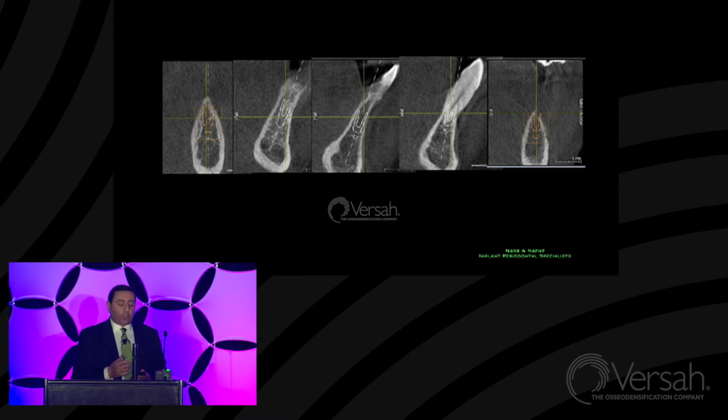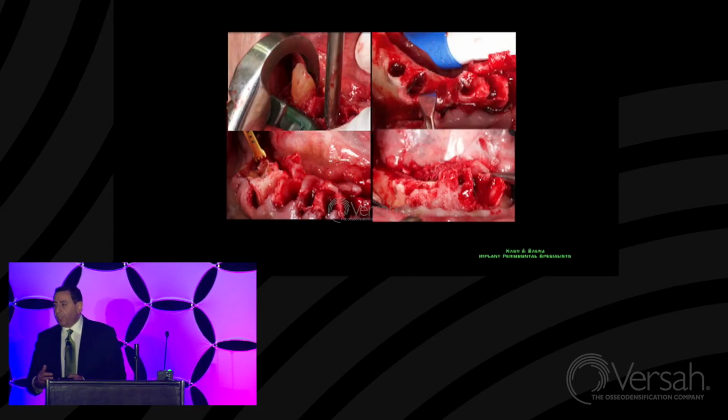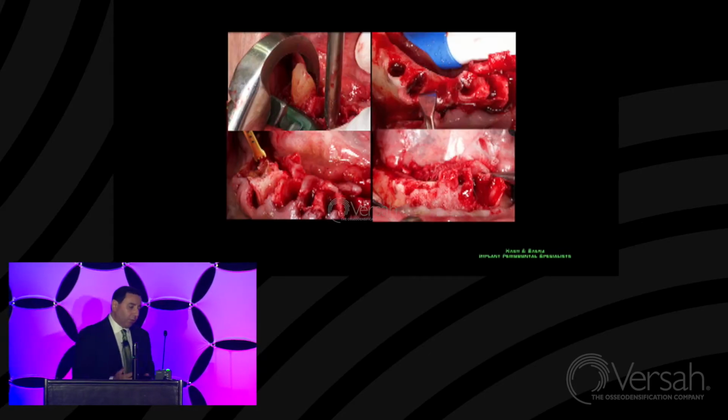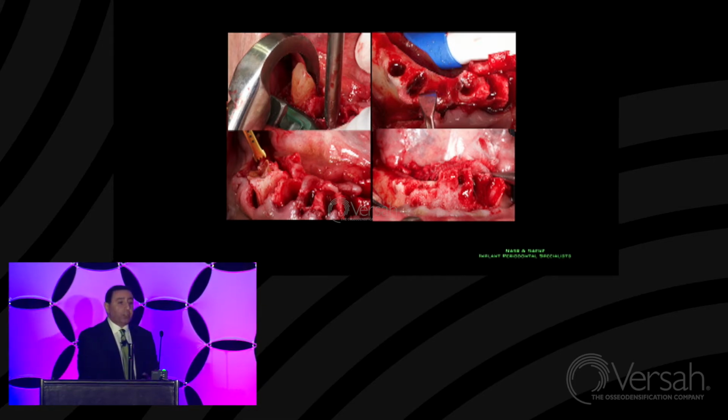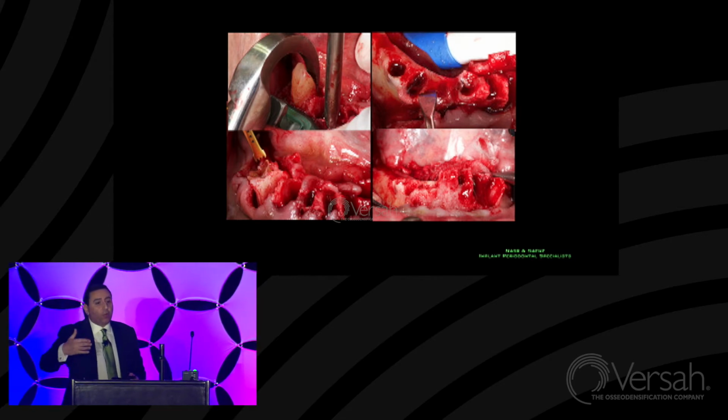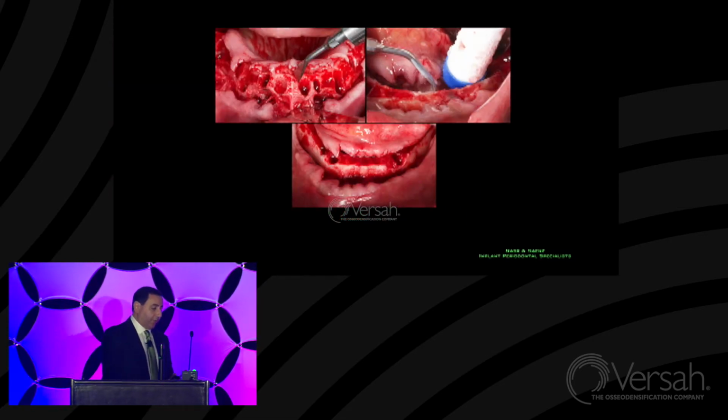So we start with our surgical procedure, and typically we do the extractions as atraumatically as possible. And we use the piezo-surgical instruments in order to flatten the ridge because it gives us a much better healing response, a little bit slower, but works quite well. You can see in the slides the area of the ridge that was tabled down with alveoloplasty versus the one that is about to be tabled down. We're continuing with alveoloplasty, and now we have a ridge that is ready to receive the implant osteotomy site preparations, and this was at a time before I was introduced to the Versah drill system.